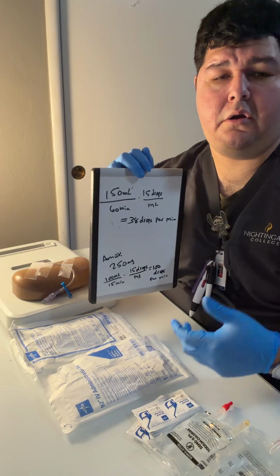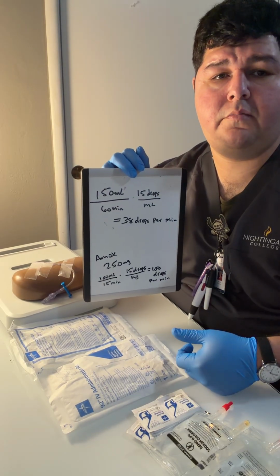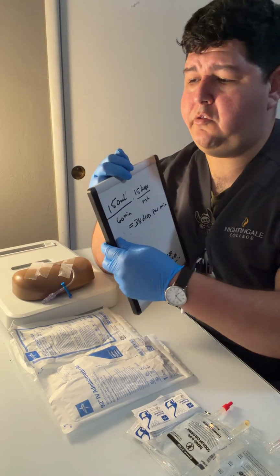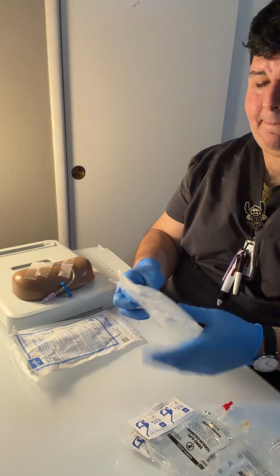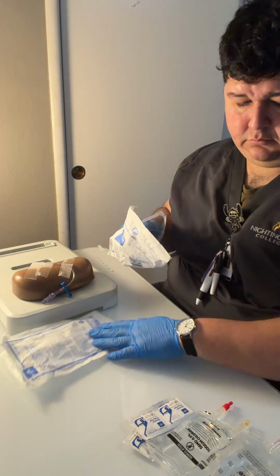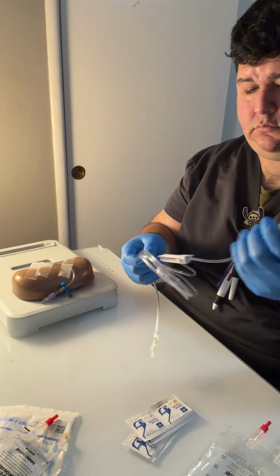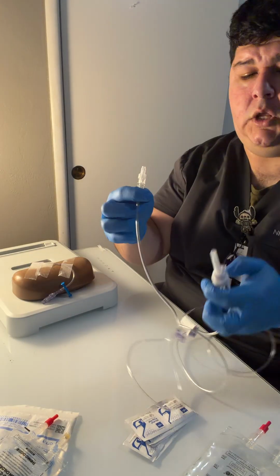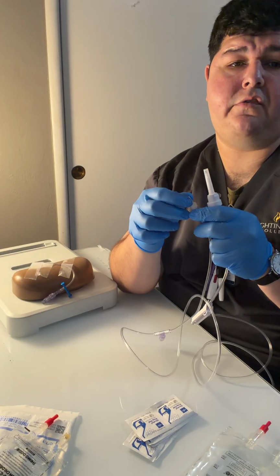And we will spike and prime our primary infusion. So we'll take our tubing and go ahead and do the spike. This portion here, this is still capped, is to remain sterile.